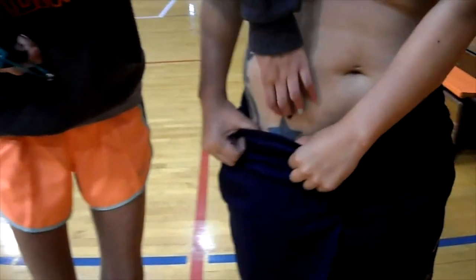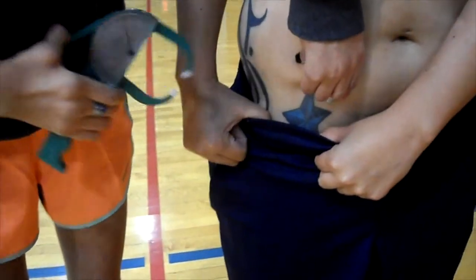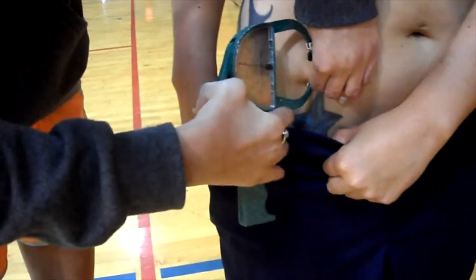The final fold is the suprailiac. This measurement should be taken in line with the natural angle of the iliac crest.